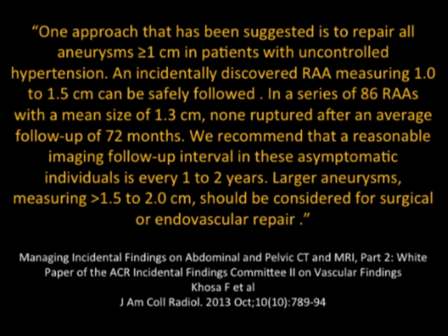In one series, they typically did not enlarge and they did not rupture. So the recommendation is a reasonable imaging follow-up interval in asymptomatic individuals is every 1 to 2 years. Again, ultrasound may be used, MR or CT. Larger aneurysms over 1.5 to 2, one should consider repair. And that is pretty much the strategy. So again, you can see that regardless of the vessel, splenic artery or renal artery, 2 centimeters always is a critical point. Renal artery, many people say 1.5 centimeters is the critical point.